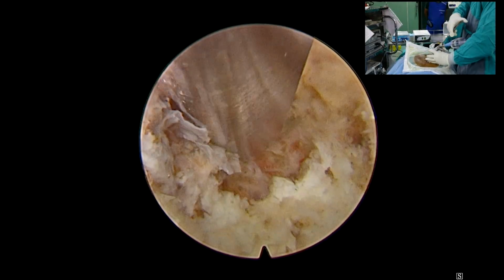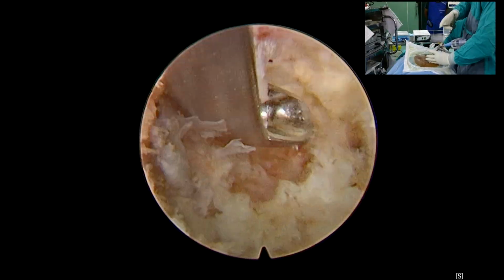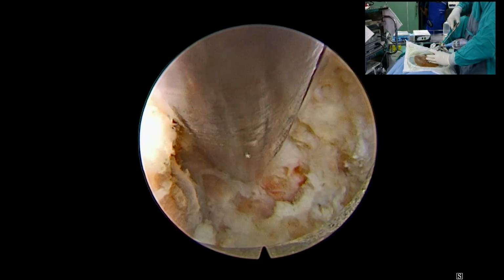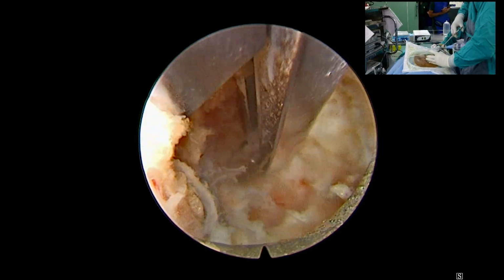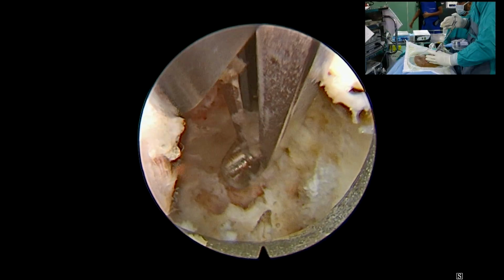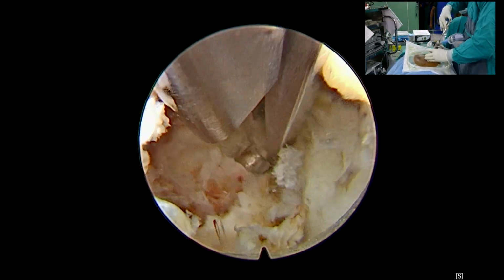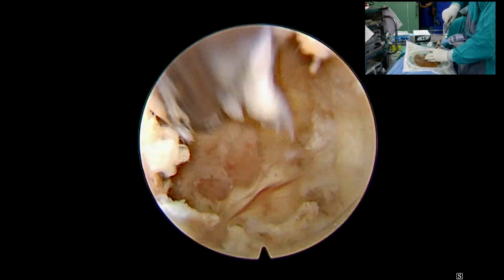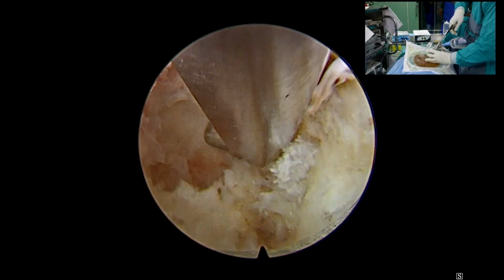Whenever we are using the Kerrison, we must put it below the bone and move it sideways to clear the structure attached below it. Sometimes, when there is thinning of the dura and neural tissue, adherence with the lamina and flavum might come below that. So we should see how he is clearing by sideways movement of the Kerrison tip.